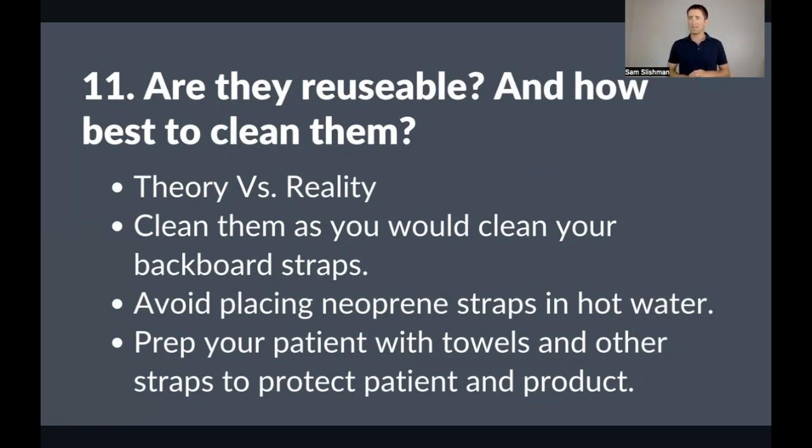Some fraction will see one patient, and then they'll go to the emergency department, and they may land on a floor, get cut up, or get lost. Then there's a sliver that get used over and over again. I've had people tell me they've used them five times, which is unusual, but happens.